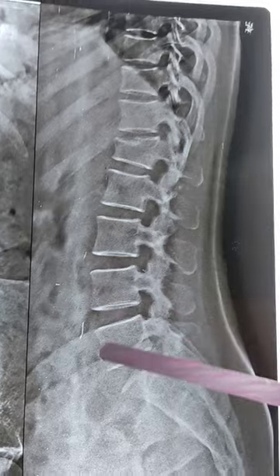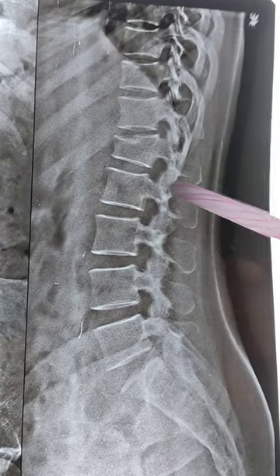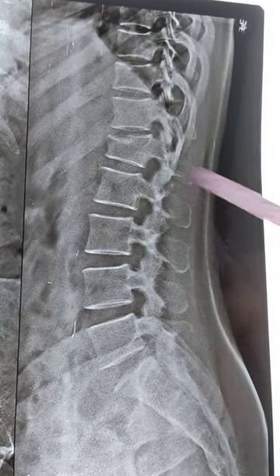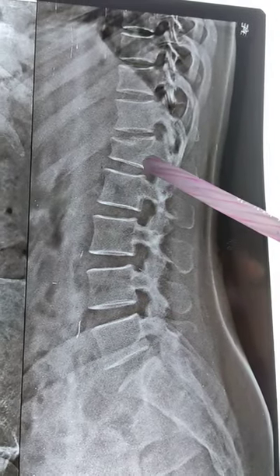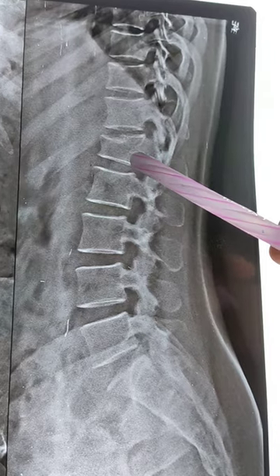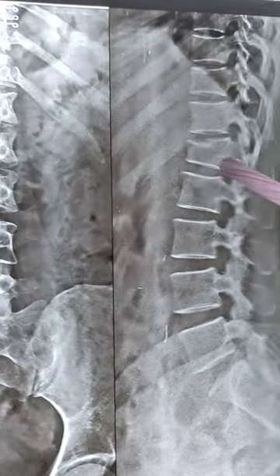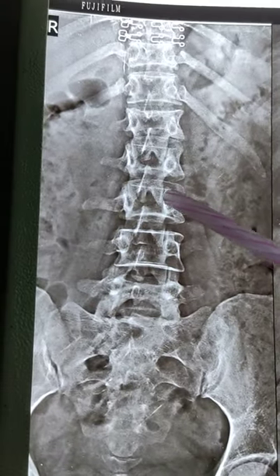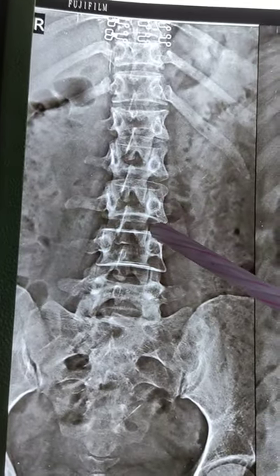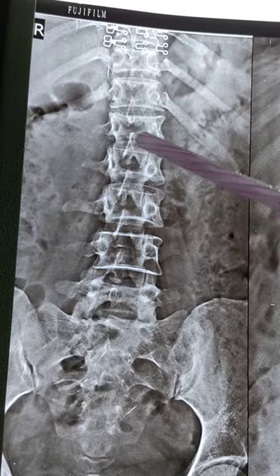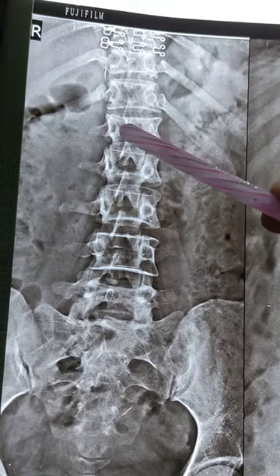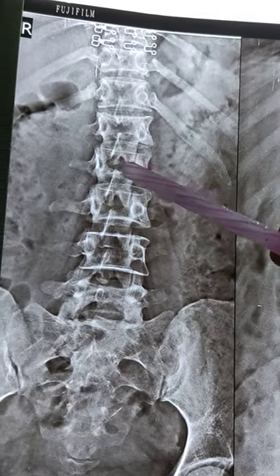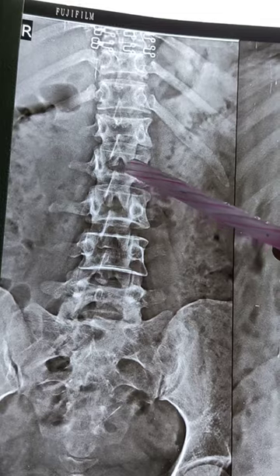This is the lateral view of an x-ray of the lumbar LS spine showing a stable L1 fracture, and this is the AP view. In the AP view as well, you can see the height of the vertebra is less when compared to the other vertebra.